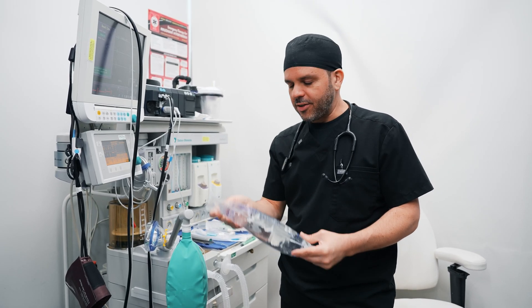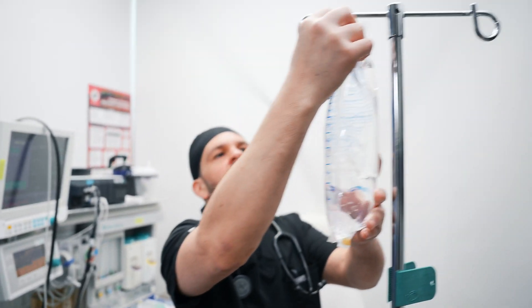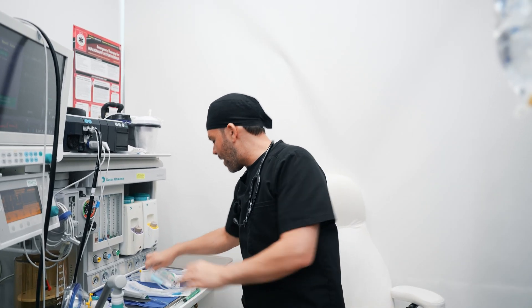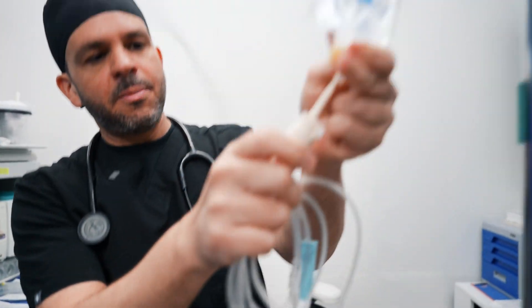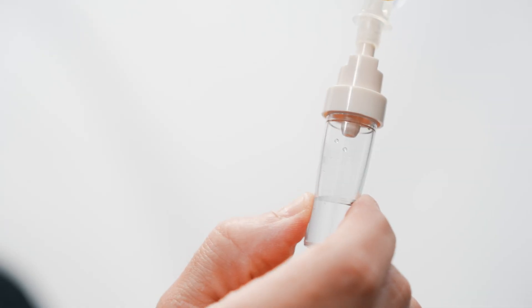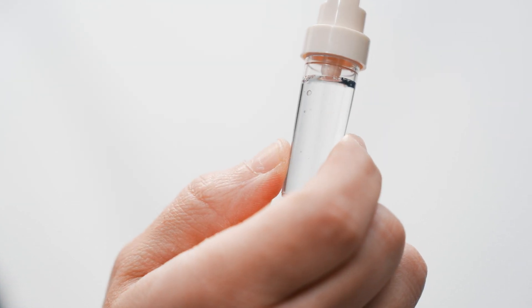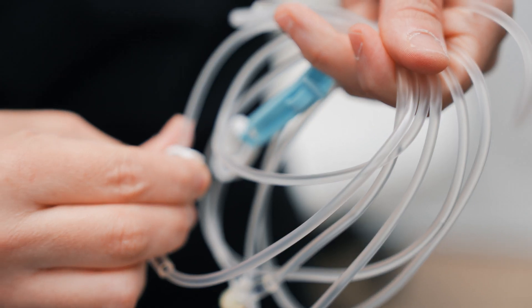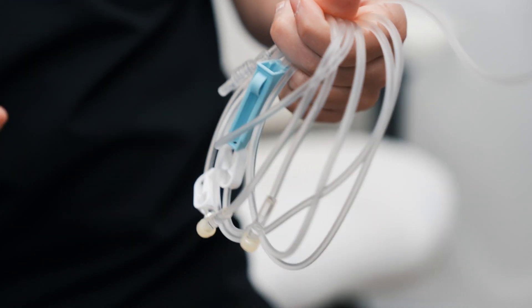The next thing I do is prepare the saline I'm going to use to give fluids to the patient. I open the bag, get one of these IV lines, and start hooking it up. One of the most important things at this point is there's an air trap here — I fill the air trap with fluid and then allow the fluid to go down the IV line and fill the whole tubing, because we don't want to deliver any air into the patient, especially if the patient has a heart condition with an opening from one side of the heart to the other, which can cause major problems.